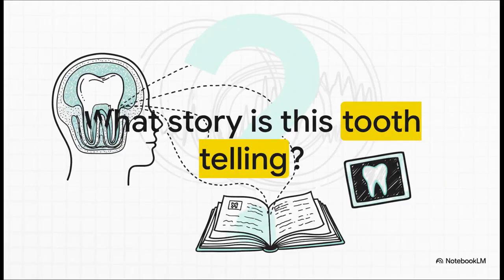So take a look at this. Every single patient, every tooth you see, has a history. But when you just do a clinical exam, when you're just looking in the mouth, you're really only seeing the cover of the book. You can see the shade, the basic shape, maybe a chip or a stain. But the real story, the stuff happening inside, that's completely hidden from view.